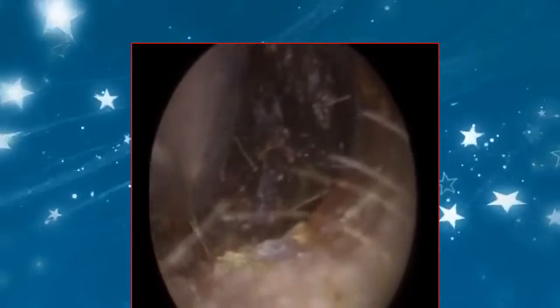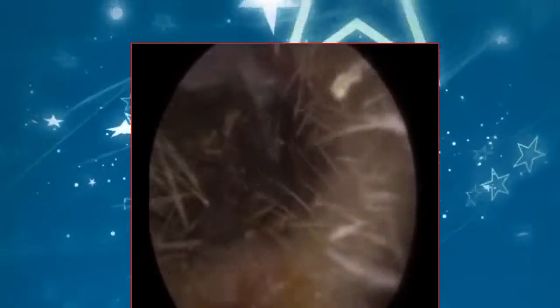When you do have hard earwax, it can be quite difficult getting a suction grip. And when the wax is this deep, it is also quite challenging to use other instruments like an ear hook or a Jobson horn. The idea here is trying to bring this wax closer to the entrance, bring it forwards, which will then allow me to use a Jobson horn or an ear hook to get in and behind the wax. The wax is also slightly matted, as you can see where I'm just tugging the wax there, there's a few loose hairs that have adhered to the wax, and that again makes getting a suction grip much more difficult. I managed to bring this wax probably about 1 centimetre towards the entrance, and I believe in a moment I'm going to go in with an ear hook.